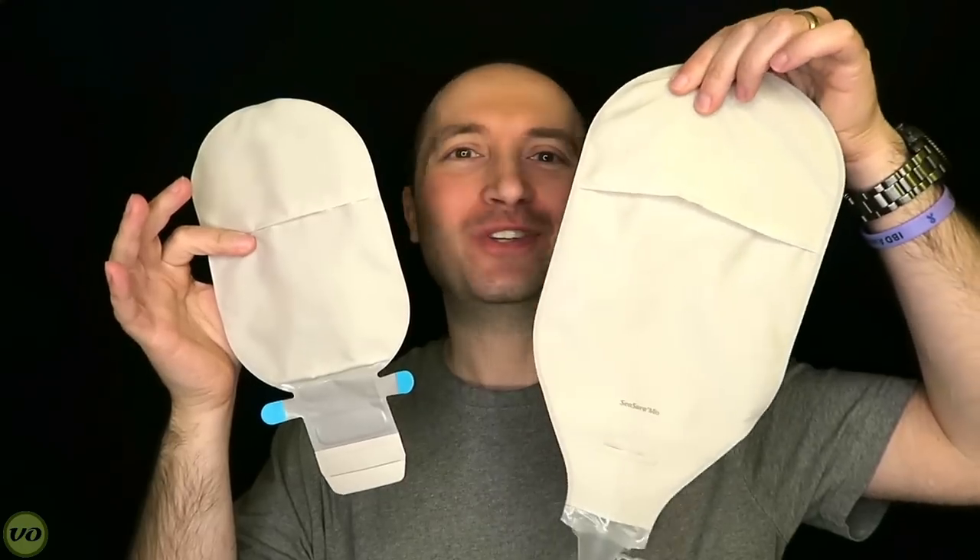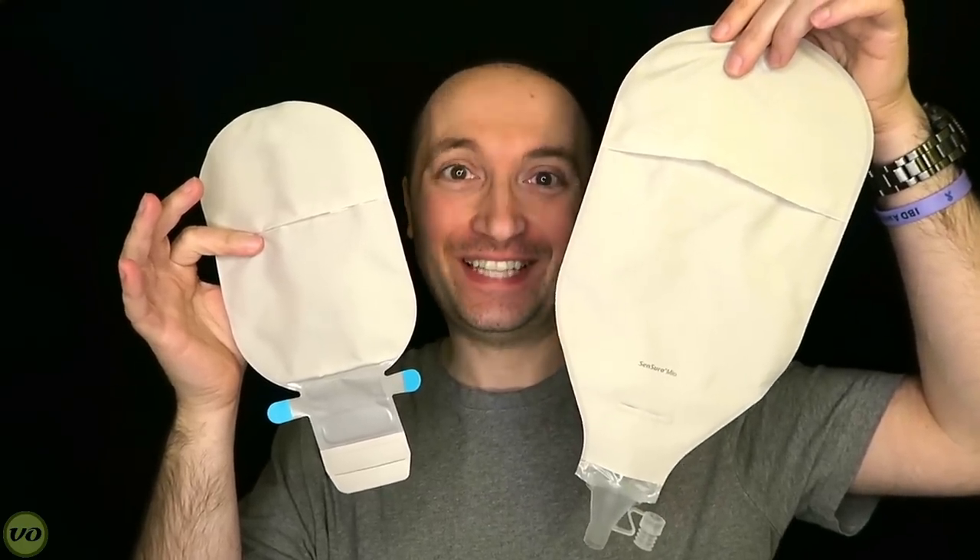Hey guys, it's Eric. If you thought that Coloplast's large bag was big, wait till you get a load of this. Stay tuned.